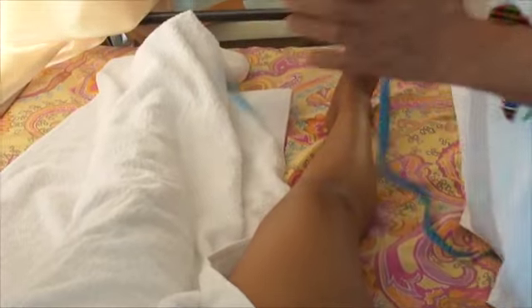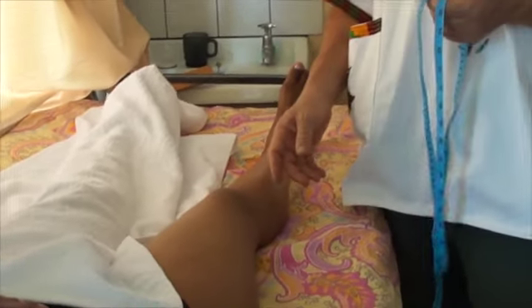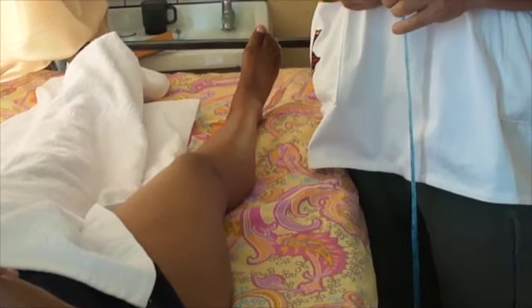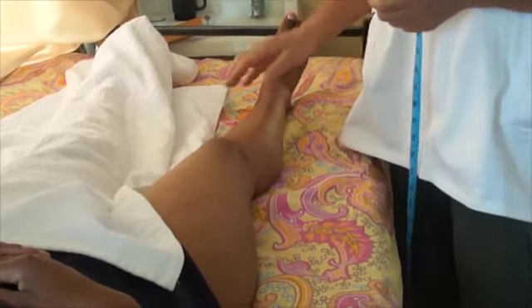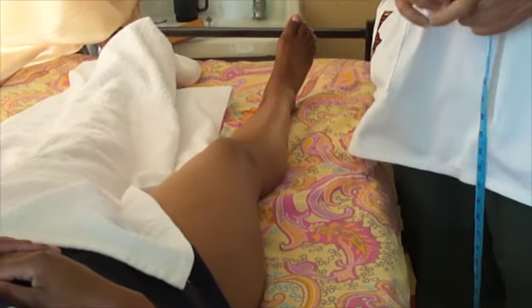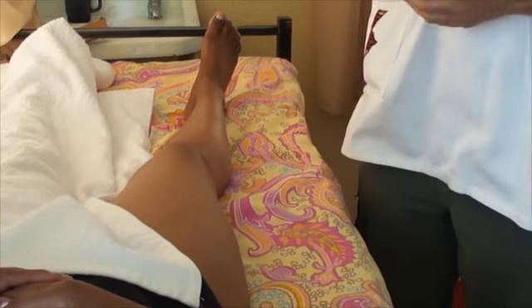These measurements we are doing at the beginning of the treatment, and then maybe after each day you can do it again. You will see if the edema is subsiding or not, or if it is mainly shifting below but less above. It can give you just a little bit of an idea of how the treatment proceeding has to be altered.